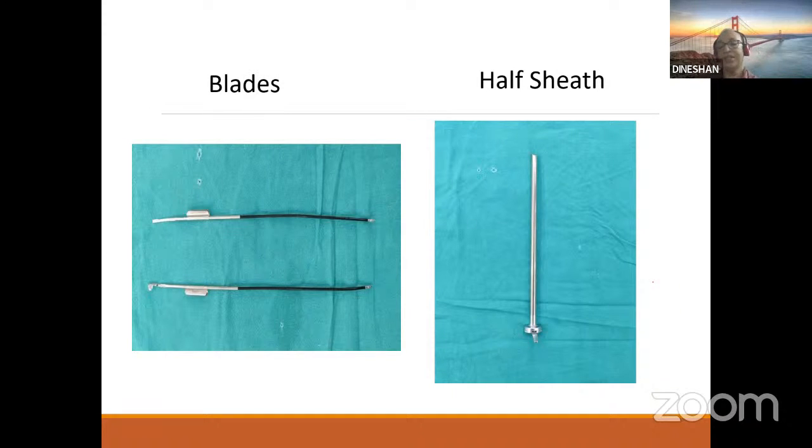There are certain occasions where patients have developed this. So if in the postoperative period you find that priapism is developing, think that you have injured the corporal bodies as well as the dorsal arteries. That is rare, but especially if you don't stick to the 12 o'clock position, it is possible.